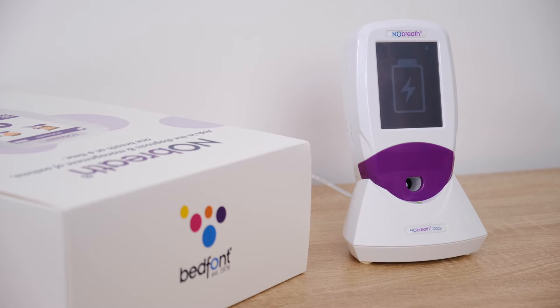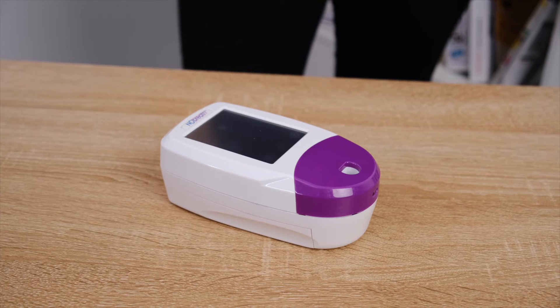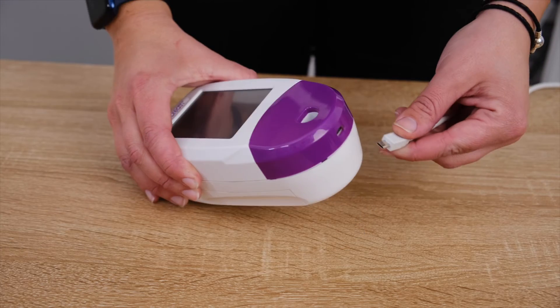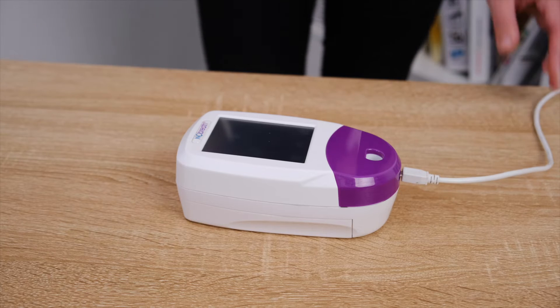The screen will indicate that the monitor is charging. Alternatively, the No-Breath Pheno monitor can be charged by plugging the micro USB cable provided directly into the No-Breath. This can then be connected either to the mains adapter or into a computer USB port.